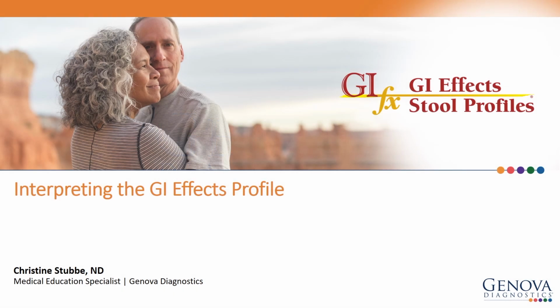Today we are going to review a GI effects report. This report is from a 62-year-old female with diarrhea that had an acute onset 2 months ago, and now it waxes and wanes. She also experiences intermittent abdominal cramping. She had a normal screening colonoscopy 2 years ago.